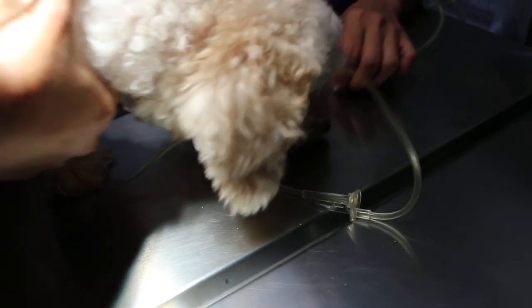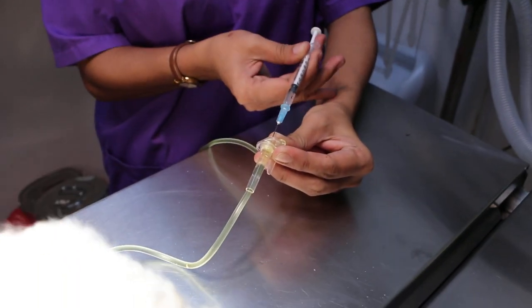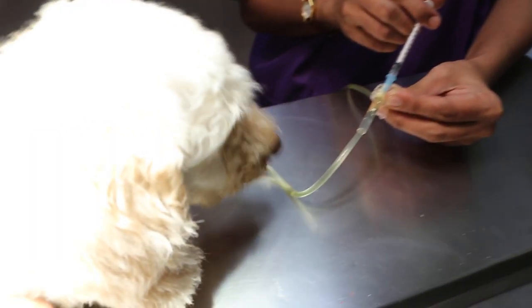Now we will show the anaesthesia. First, we will give pre-medication or sedation. This is Zoletil 2.5mg — Zoletil 100 — given by IV through the drip.